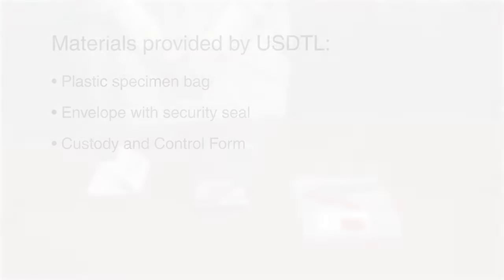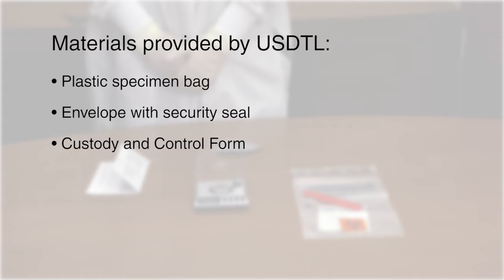Welcome to USDTL's Hair Collection Instructions video. Materials provided by USDTL include a plastic specimen bag, an envelope with security seal, and a custody and control form.